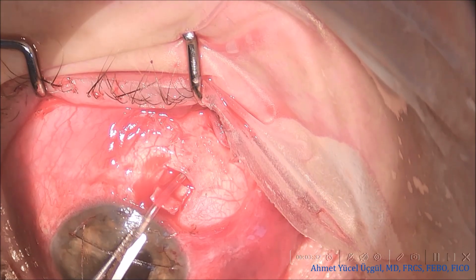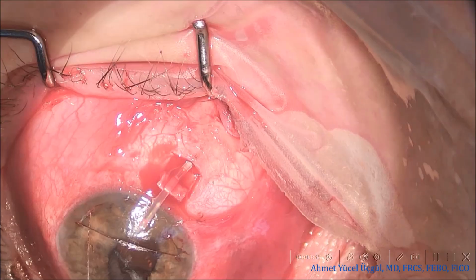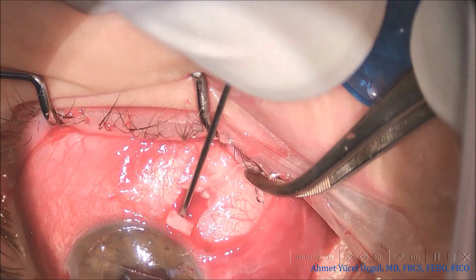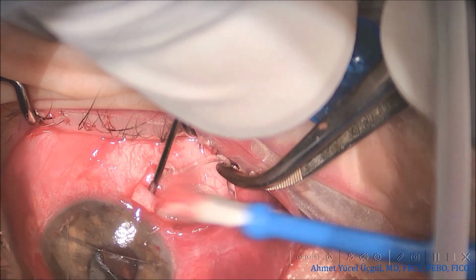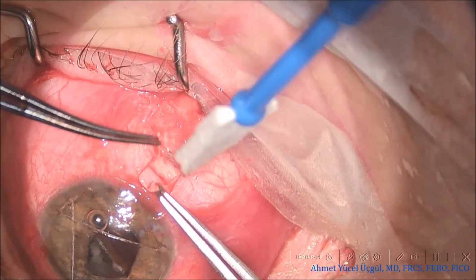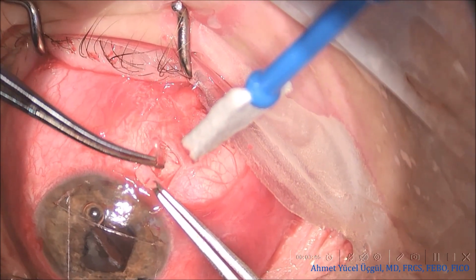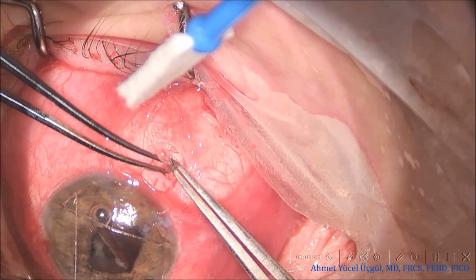For sulcus insertion, the tube is trimmed bevel down to reduce the risk of iris tissue obstructing the lumen. I also leave it slightly longer than I would for anterior chamber placement since endothelial trauma is not the primary concern in the sulcus. In contrast to the PGI case, the entry tract here is created with a 23-gauge needle rather than a 26-gauge needle, better matching the dimensions of the Ahmed tube.